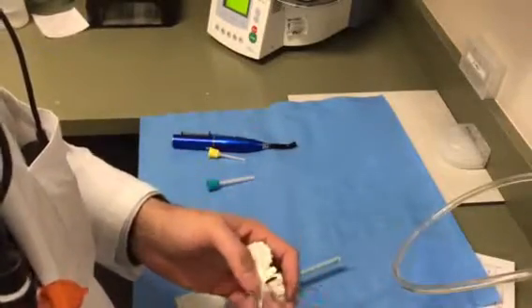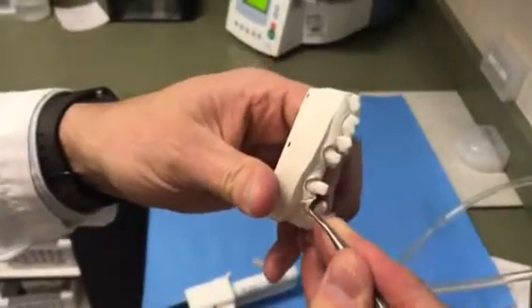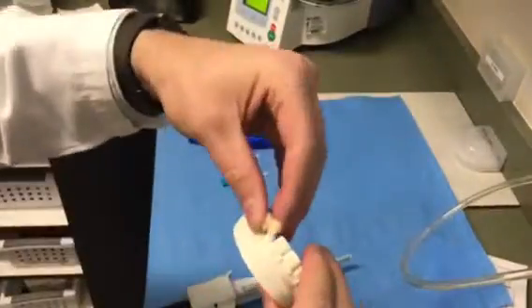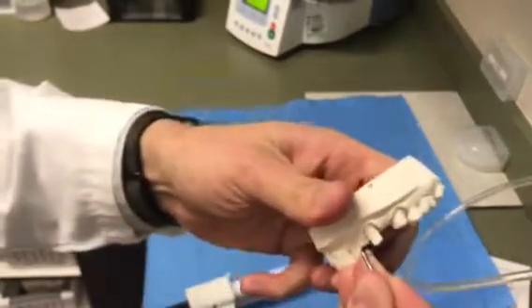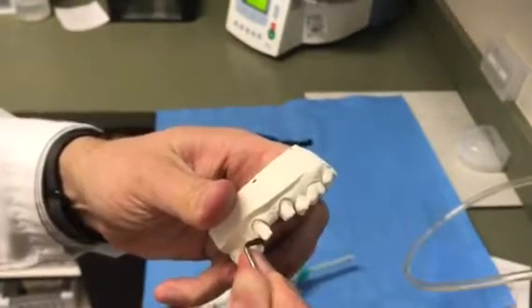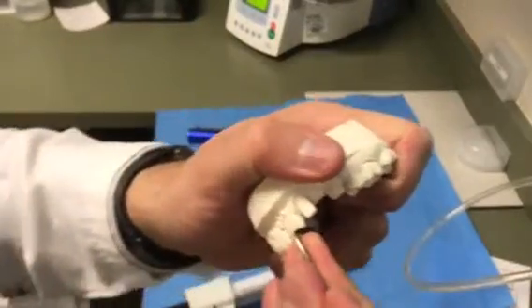I just take an instrument, usually the perio scaler, and I'll go in there and shave, and pry that in, like, oh nope, it's still more open in the mouth than it is here. Then I'll go back and just shave that. And then I go back and forth with the mouth multiple times, confirming, all right, yeah, that's what it looks like in the mouth.